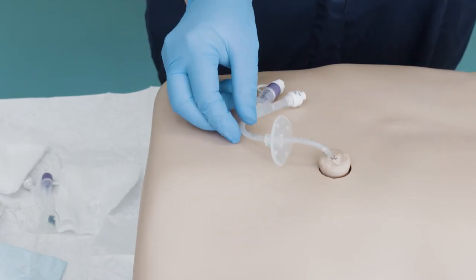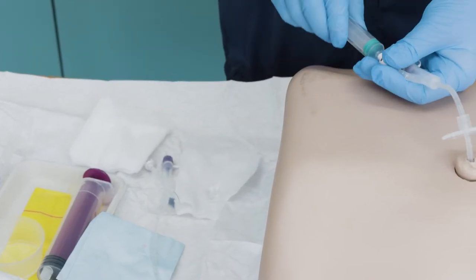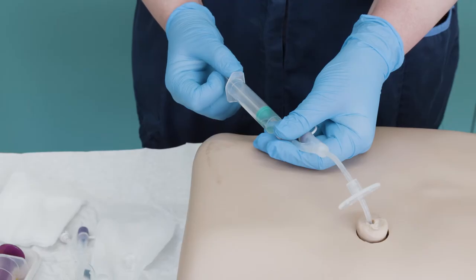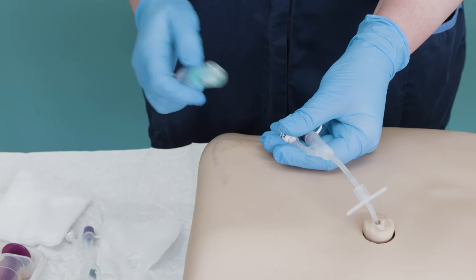Use a 5ml Luer slip syringe to deflate the balloon of the existing tube by gently drawing back the plunger on the syringe until no more fluid comes out of the balloon. This should be done twice to ensure the balloon is fully deflated.